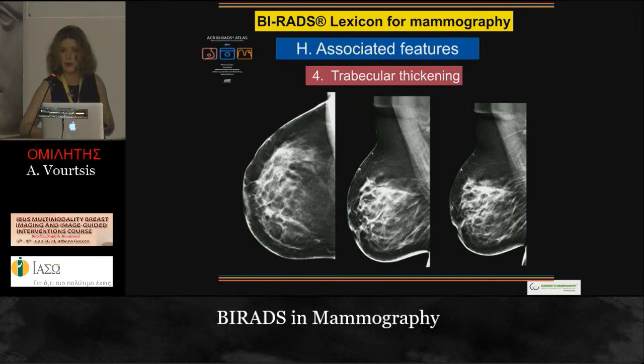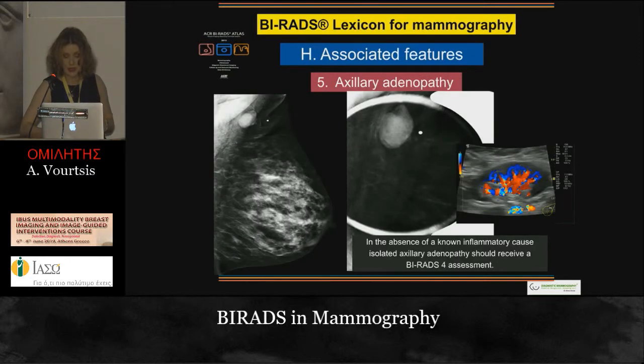It might represent an inflammatory cancer, simple mastitis, or in other cases post-radiation changes, but further evaluation of these patients is needed whenever the patient comes to your center. If you have previous examinations, you can see that it is just edema due to post-operative changes or post-radiation and should decrease through time.